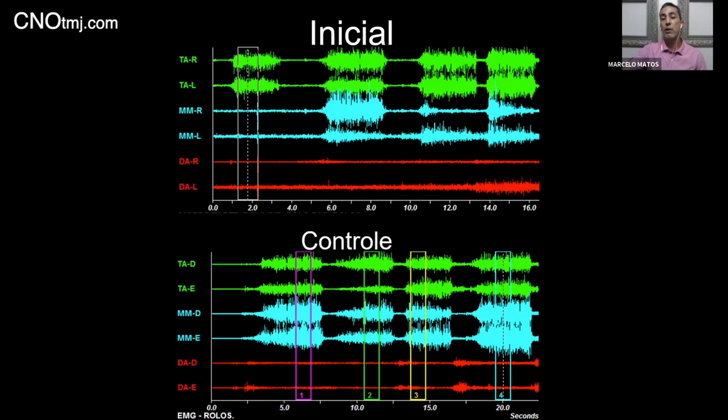So a quick way to check what is going on over time with the joint is the mastication analysis, as we talked about in the other part. And to check the height, actually the three-dimensional position with a focus on height, this test works really great. But take care if there are no natural teeth, only implants, and if the all-on-four does not extend too much to the back, only to the first molar level, sometimes the pressure is going to make the mandible shift, and you won't have a very nice reading of the EMG because you are lacking some dental aspect of the equation.